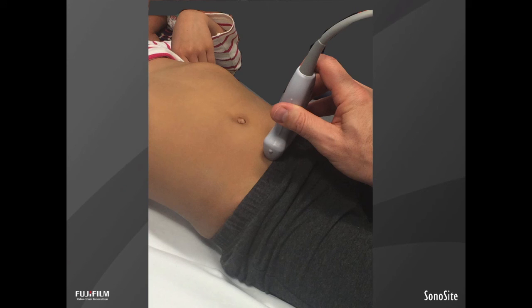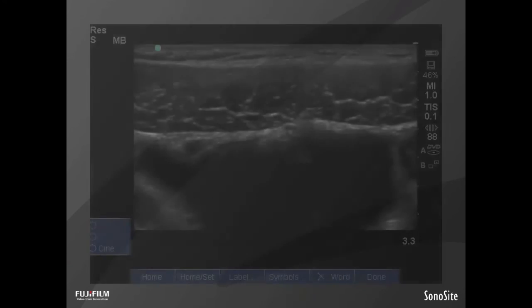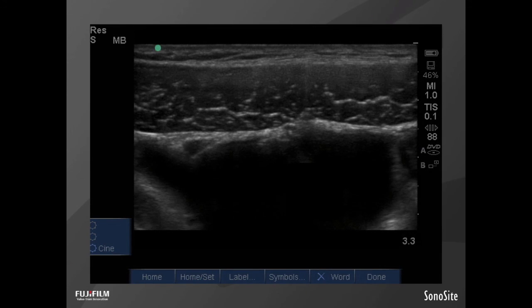The starting position is with the high frequency linear probe in the transverse plane, with the marker pointed toward the patient's right, right above the pubic symphysis, angled down into the pelvis. That gives us a nice view of the bladder. Since we have a relatively shallow depth and most of these children are relatively young, we're not going to see the entire bladder itself, so you have to get accustomed to just seeing the most superficial part. You can deepen your depth, get a full view of the bladder, and then shallow back up.